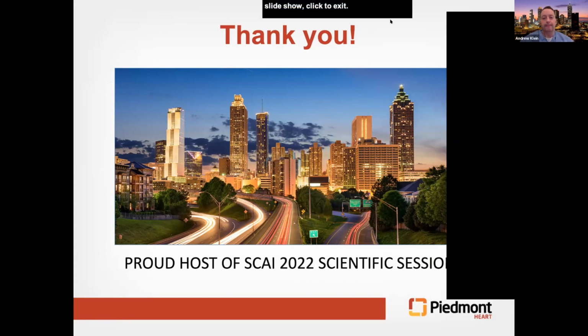Thank you. Drew, thank you. I wouldn't mind if my co-panelists jump in with questions, but I do have one before we move to Alyssa. Drew, just for the audience, how do you break it down, how do you decide when to debulk? Do you look at a CT-based calcium, you have a CT scan, or you look at fluoroscopic calcium when you're getting access or imaging the vessel, or you do IVUS and you differentiate between intimal and deep wall, and some people even use OCT. I don't, but for peripheral arteries, for SFA and femoral popliteal, how do you decide?